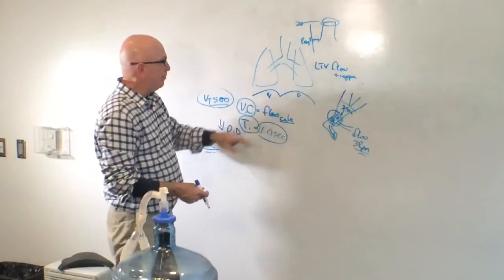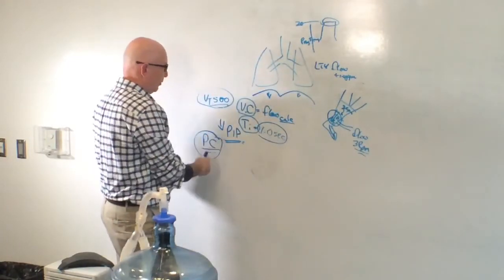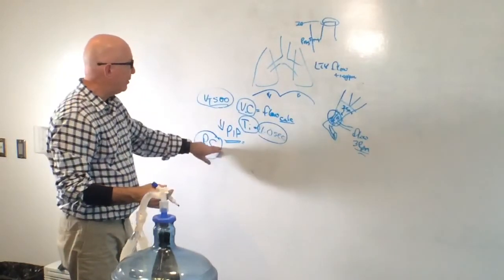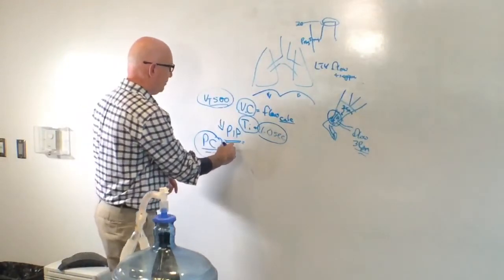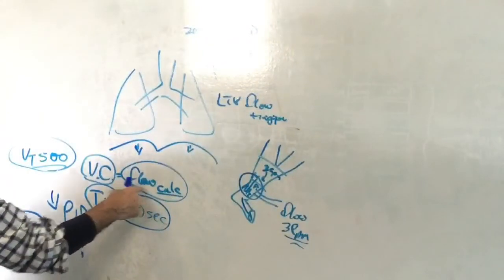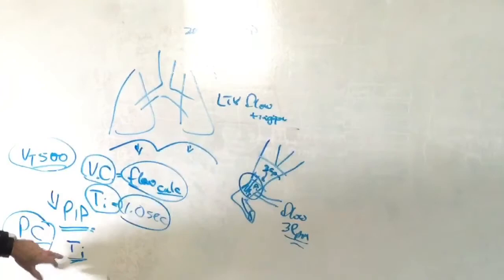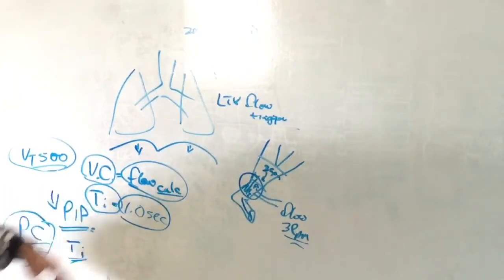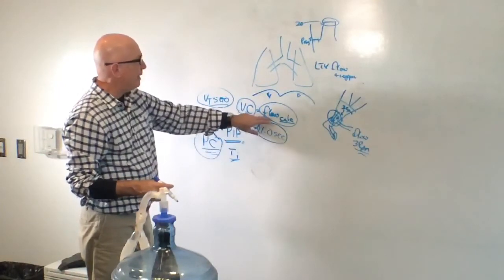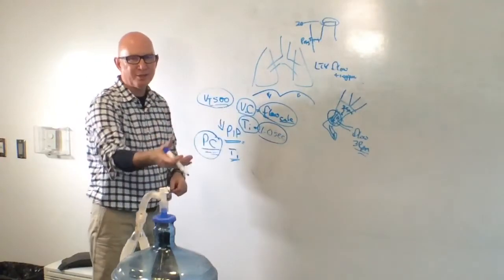The next point that's important here then is, we're talking about inspiratory flow. If they're in pressure control, we don't have direct control over the flow rate in pressure control, even though, if you change the I time, you've probably noticed that the flow calculation changes in the display, even though you're in pressure control when you're changing the I time. And it's simply because it's one of the idiosyncrasies of the LTV 1200 that when you change the I time, it's simply resetting the calculated flow based on the tidal volume should you change to the tidal volume mode.